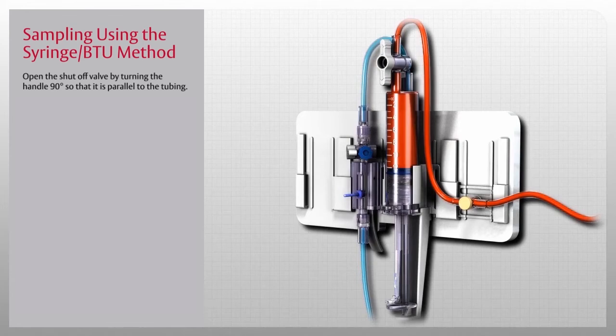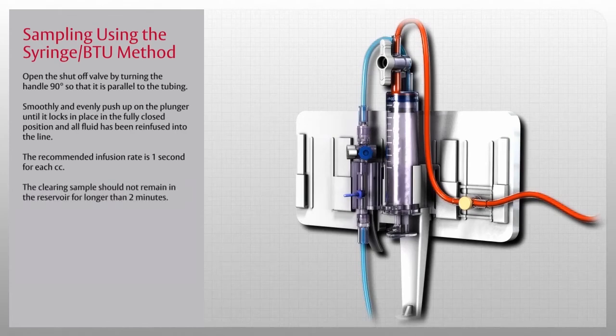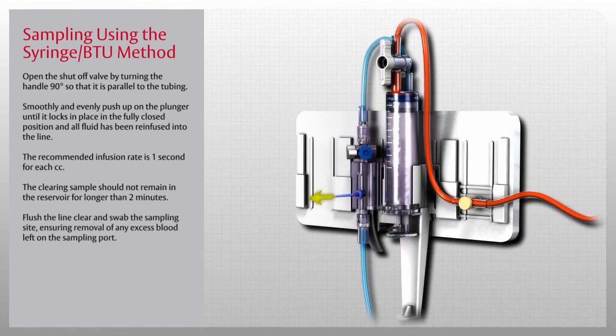Once the sample has been drawn, open the shutoff valve by turning the handle 90 degrees so that it is parallel to the tubing. Smoothly and evenly push up on the plunger until it locks in the fully closed position and all fluid has been re-infused — you will hear an audible click. The recommended infusion rate is one second for each cc. Note that the clearing sample should not remain in the reservoir for longer than two minutes. Flush the line clear and swab the sampling site to remove any excess blood from the sampling port.